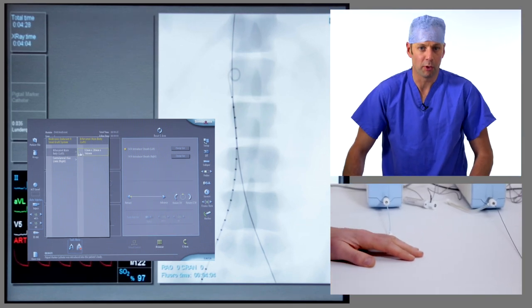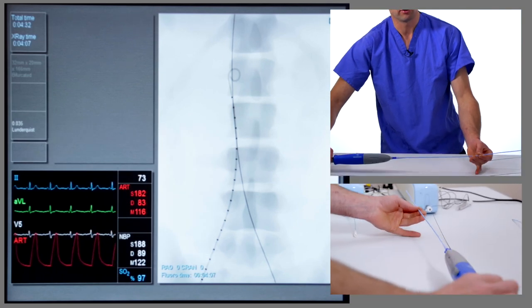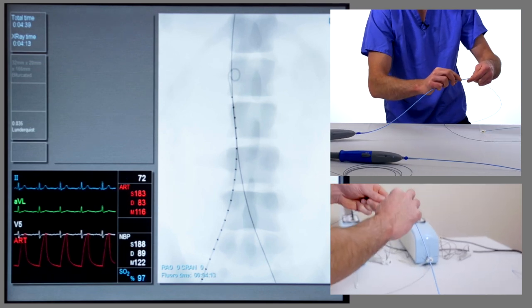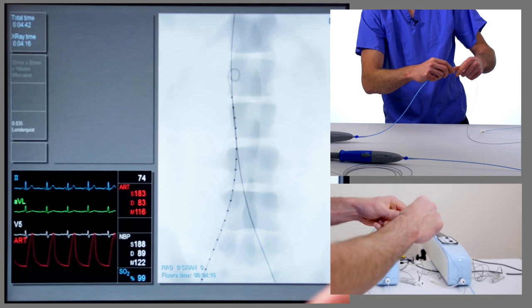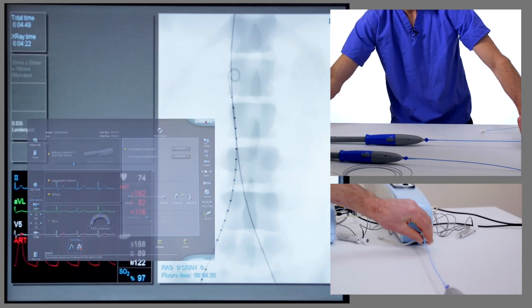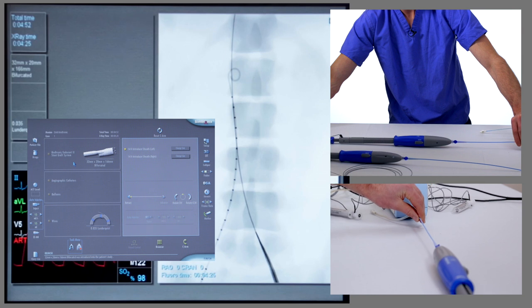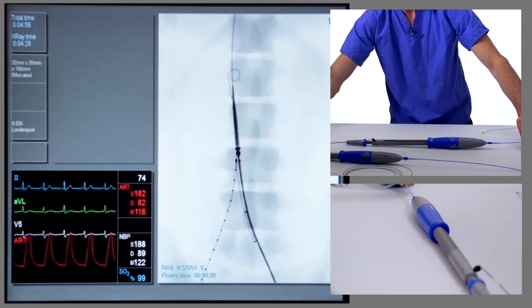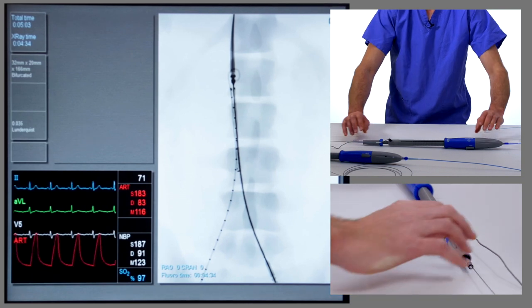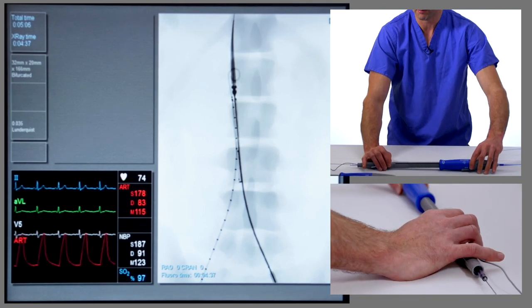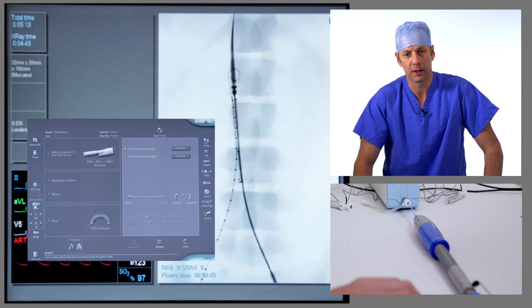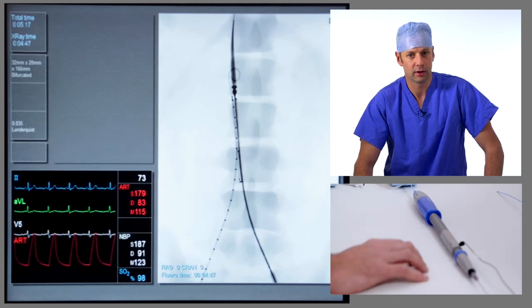Now we have to introduce the main body. This is the Medtronic Endurant II stent graft delivery system, and we're going to place this over the Lunderquist wire via the left groin. This is a 26mm aortic lumen, so we're going to introduce a 32mm diameter stent graft. 32mm is 20% oversize, which is within IFU for the Medtronic system. This is a 166mm long two-piece system with a 20mm distal ipsilateral limb.